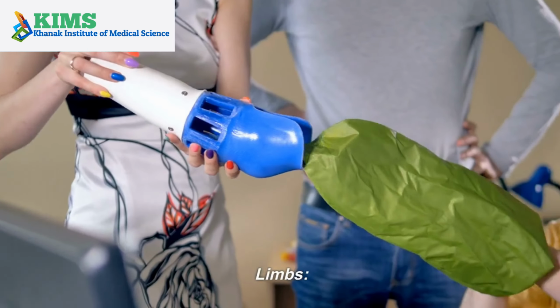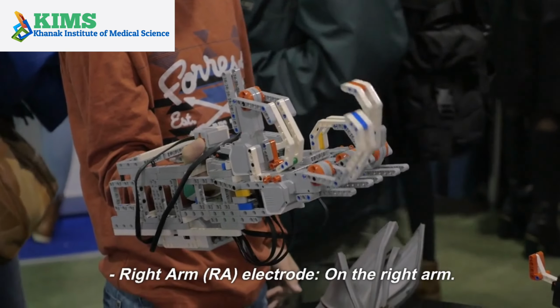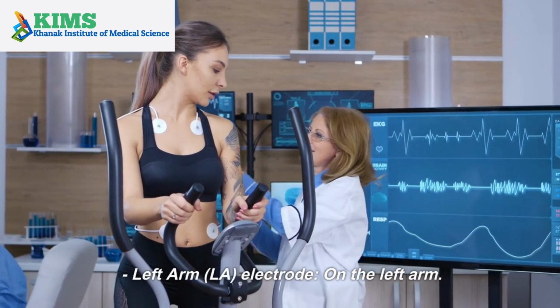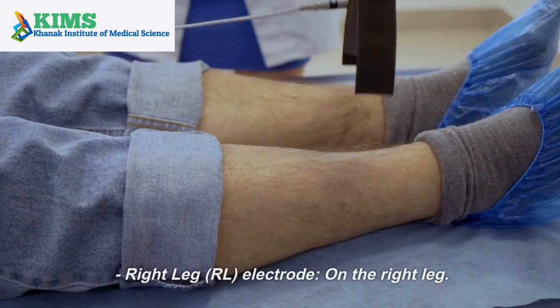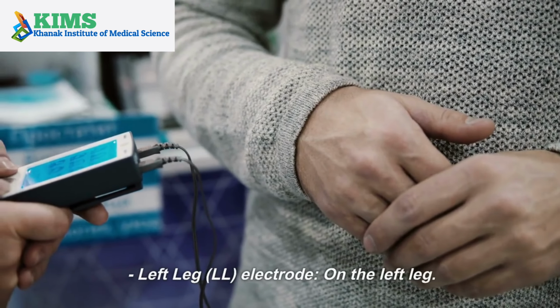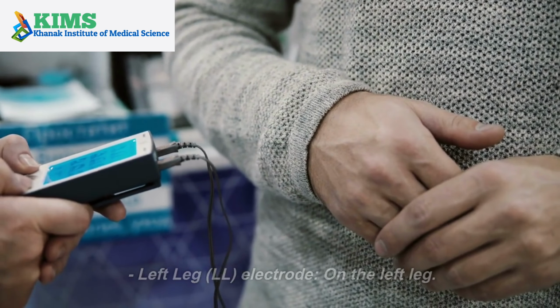1. Limbs. Right arm, RA, electrode on the right arm. Left arm, LA, electrode on the left arm. Right leg, RL, electrode on the right leg. Left leg, LL, electrode on the left leg.